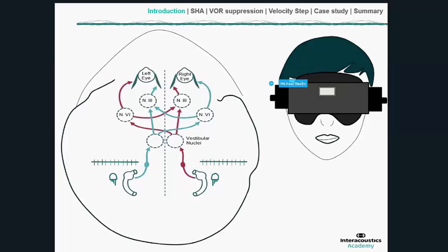And over here we can see a picture of the instrumentation that we can use, video oculography, to track the eye movement there.